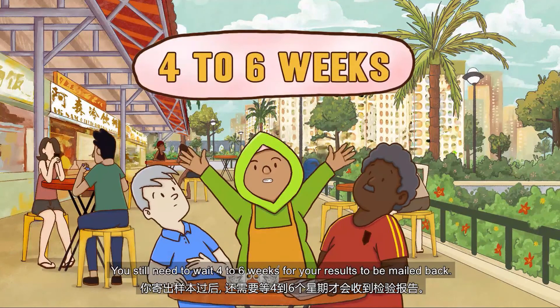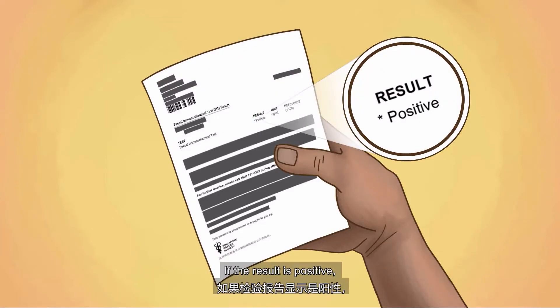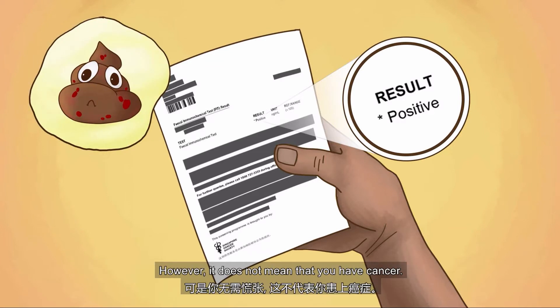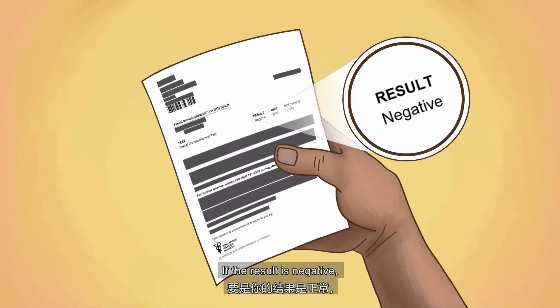You still need to wait four to six weeks for your result to be mailed back. If the result is positive, it means there are traces of blood in the stool that are invisible to the naked eye. However, it does not mean that you have cancer. A nurse coordinator will call you to fix a medical appointment. If the result is negative, repeat the test next year.